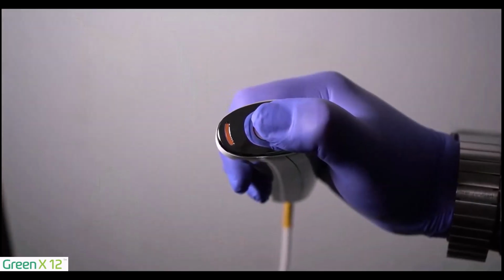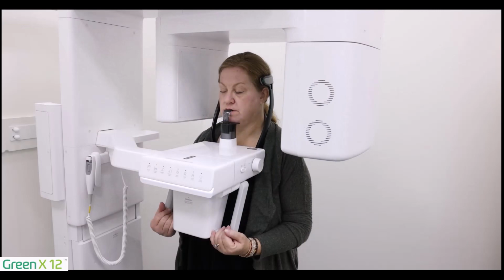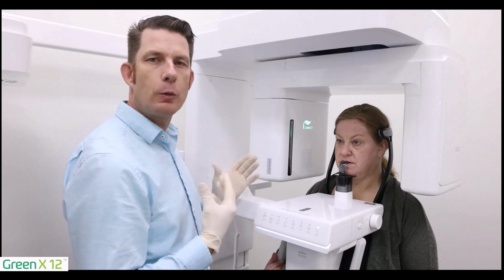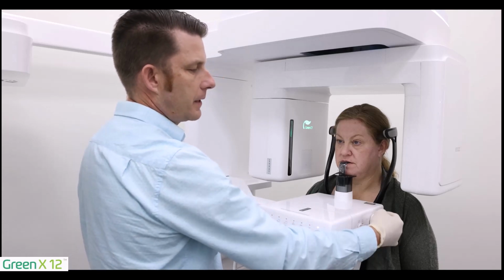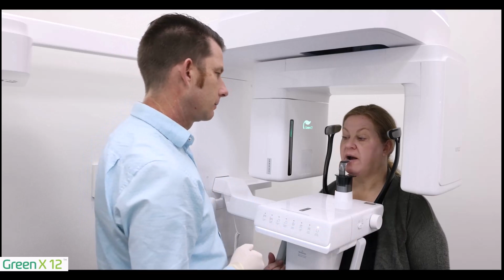Hold the button until the image acquisition is fully complete. Image capturing is complete. Please wait a moment. Once image capture is complete and the overhead stops rotating, we can let our patient out of the device. I'm going to go ahead and release the temple supports by opening them here with the wheel. We can go ahead and have our patient step out of the machine.